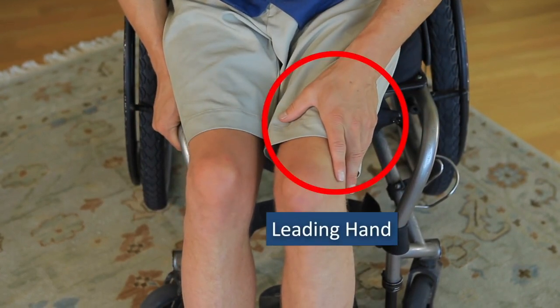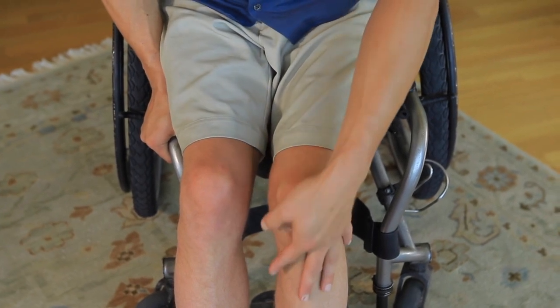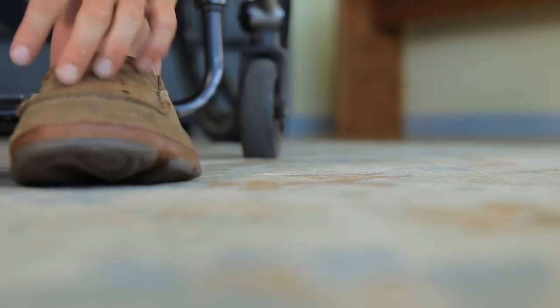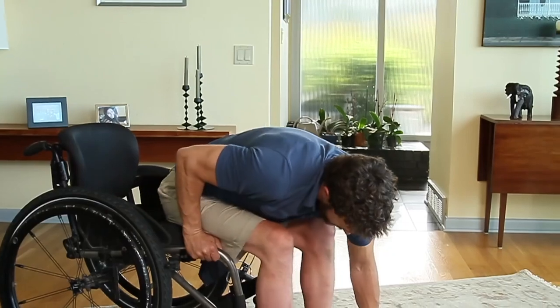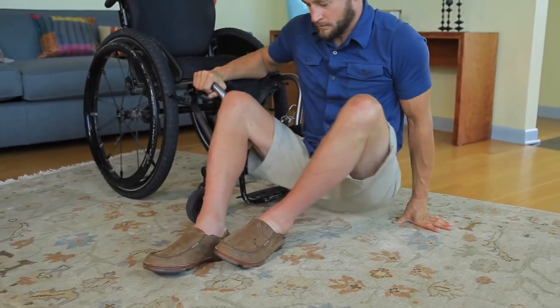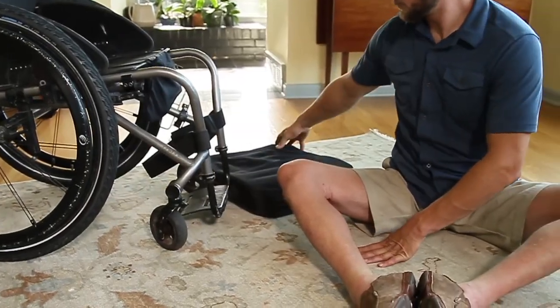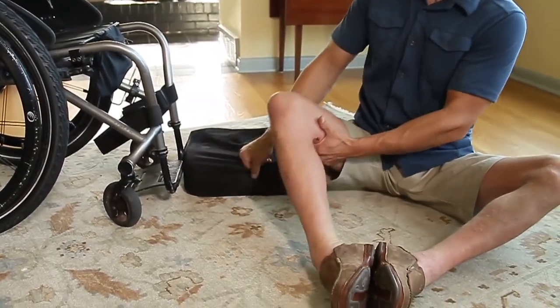Stabilize with your leading hand on your knee, sliding the hand down your leg to the floor as you bend forward at the waist. While propping on your hands, slowly lower your hips from your seat diagonal to the floor. Pull a mat or your wheelchair cushion underneath you to protect your skin if you're spending time sitting on the ground.